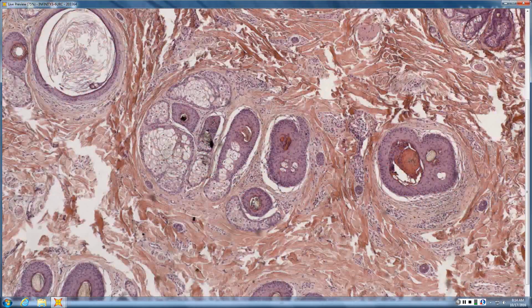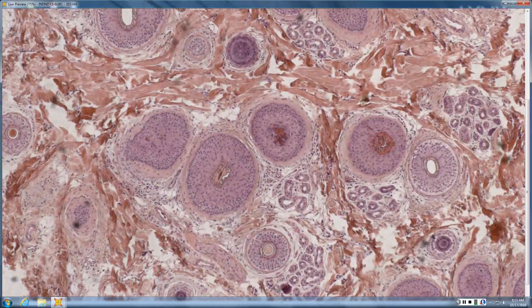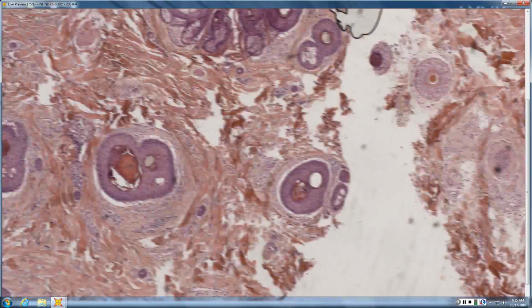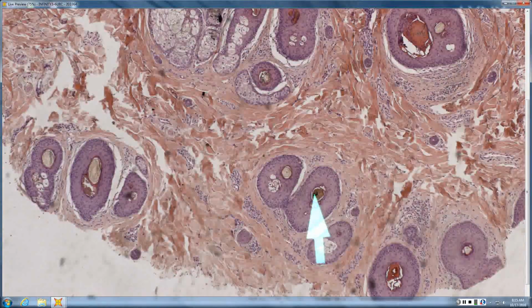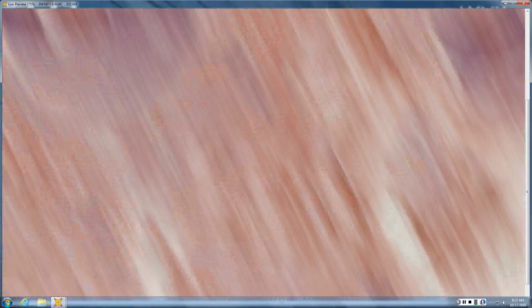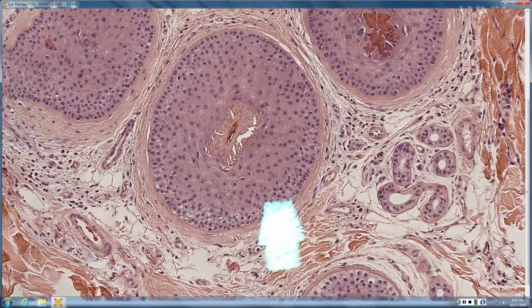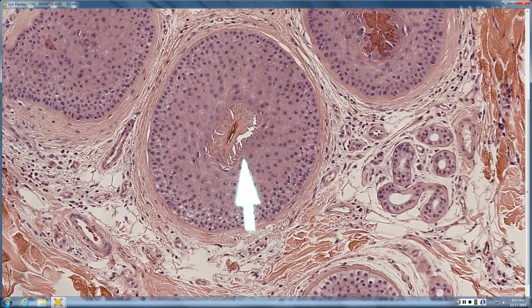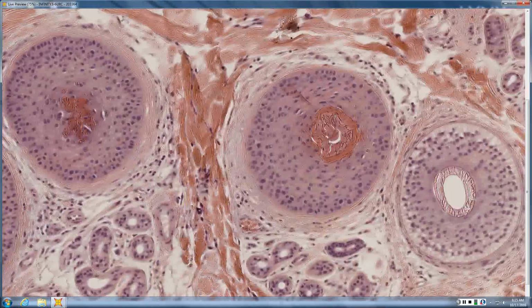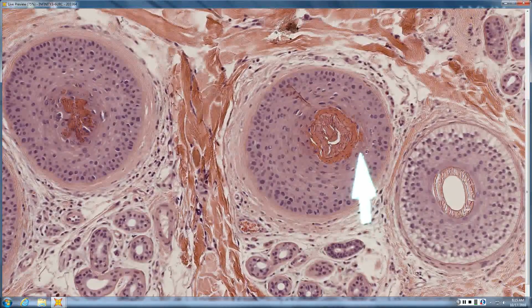Based on how this is cut, I'm thinking that they want an alopecia. So we're looking at transverse sections of a punch, which commonly is how we treat alopecia. Hair density, at least in this piece, looks okay. There are pigment casts in the hair channel, and there's a little bit of inflammation on that other piece. What kind of hair is this? Do you see an intact hair in it? No. And your cuticle is kind of ragged. It's kind of in a weird shape, collapsed, and here's another one. And you have some individual necrotic keratinocytes.